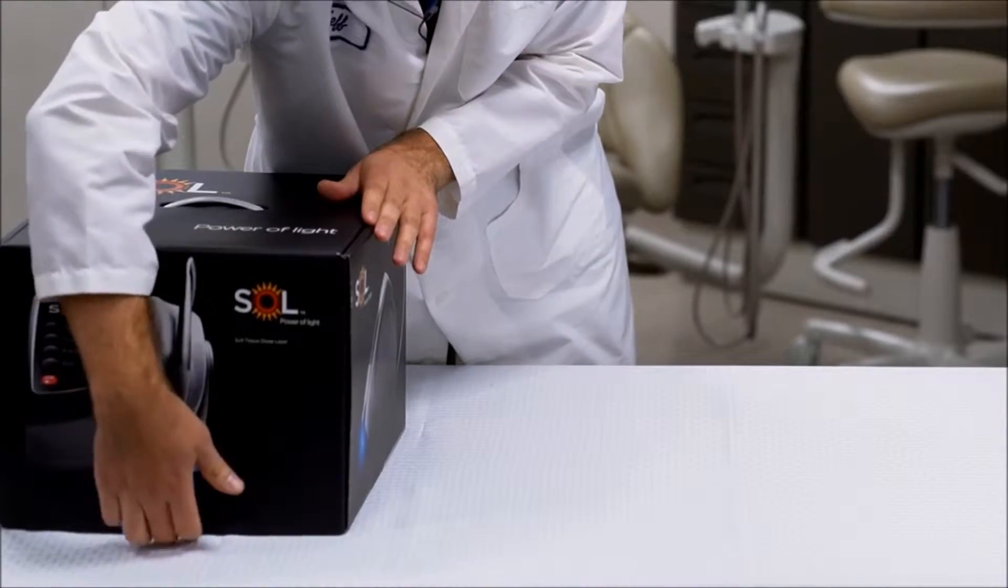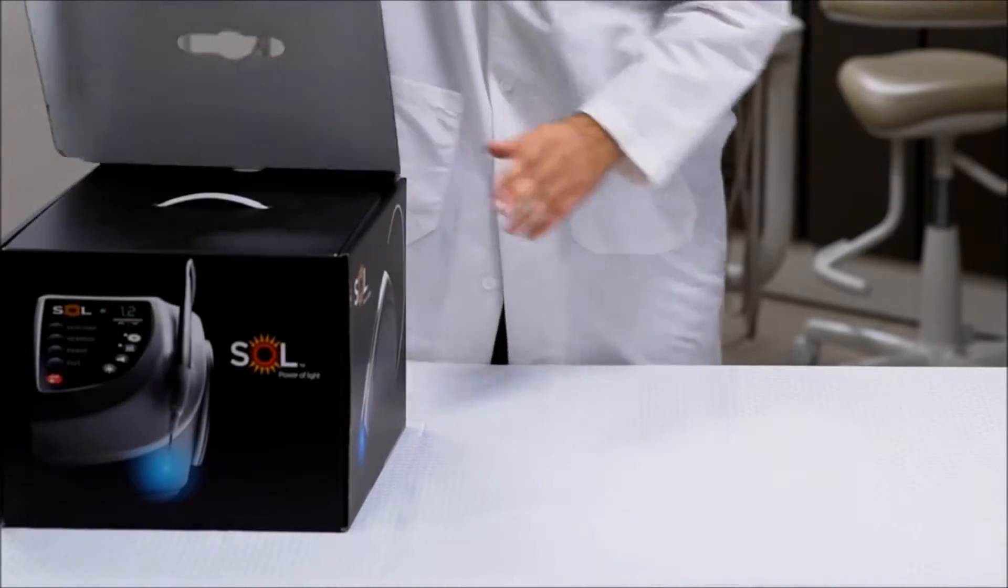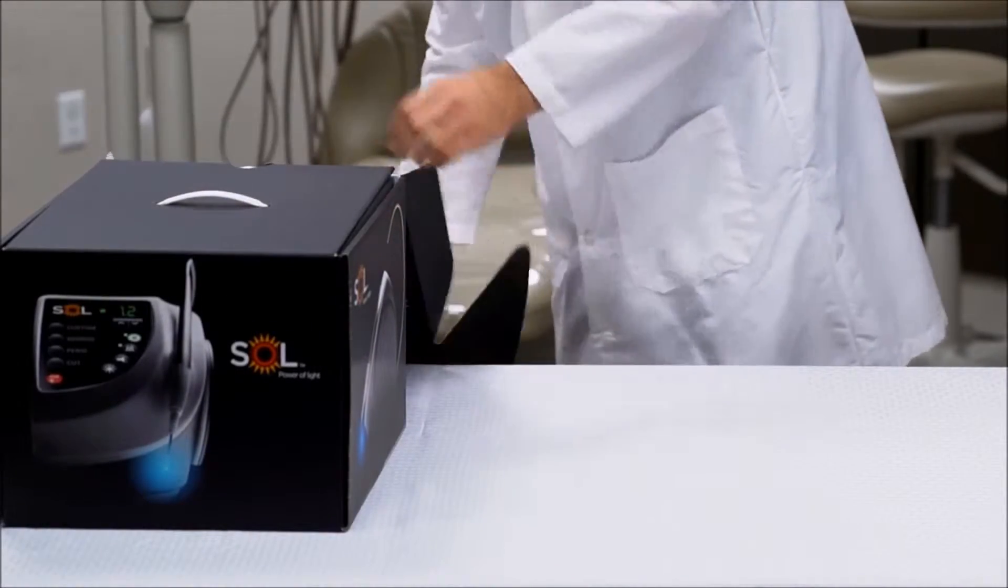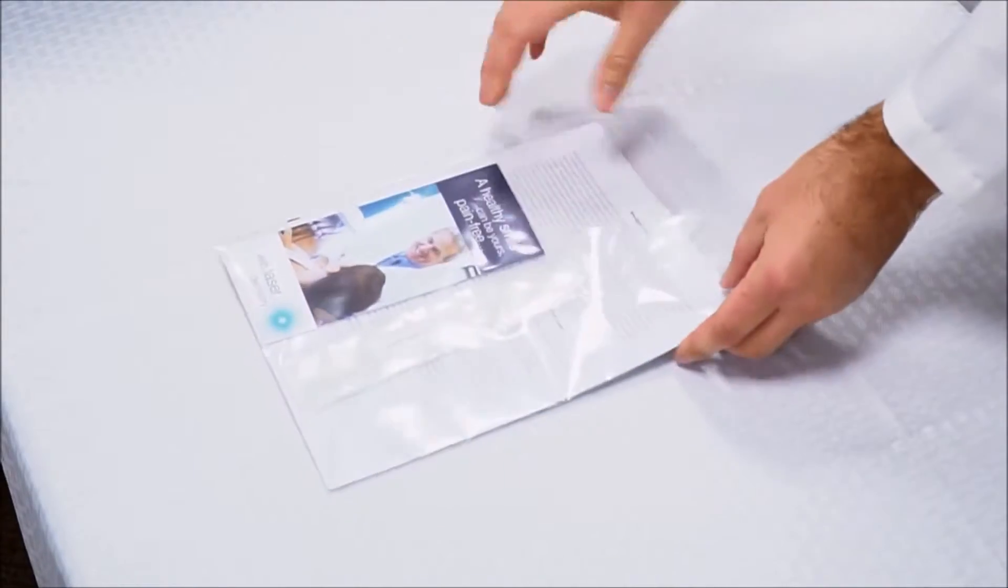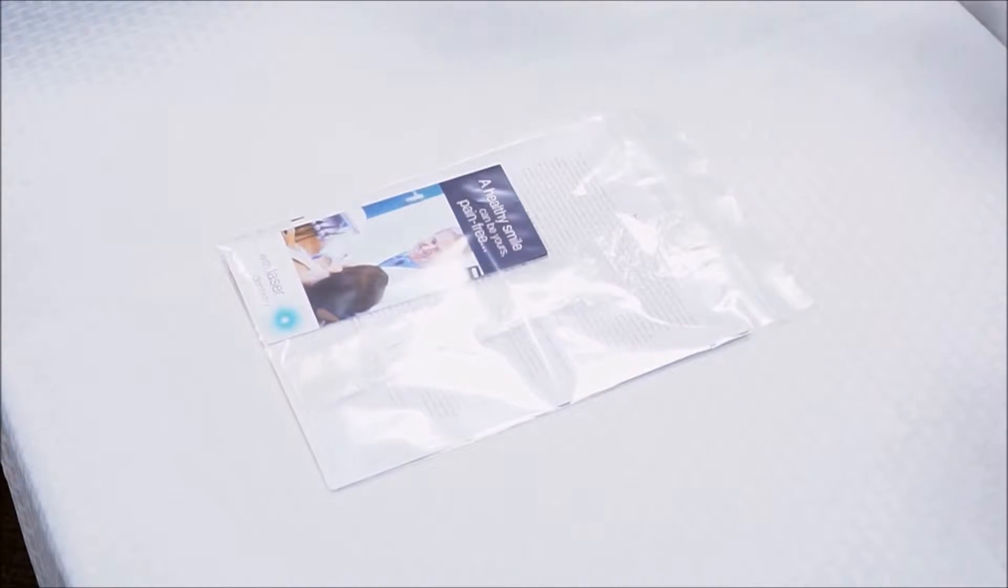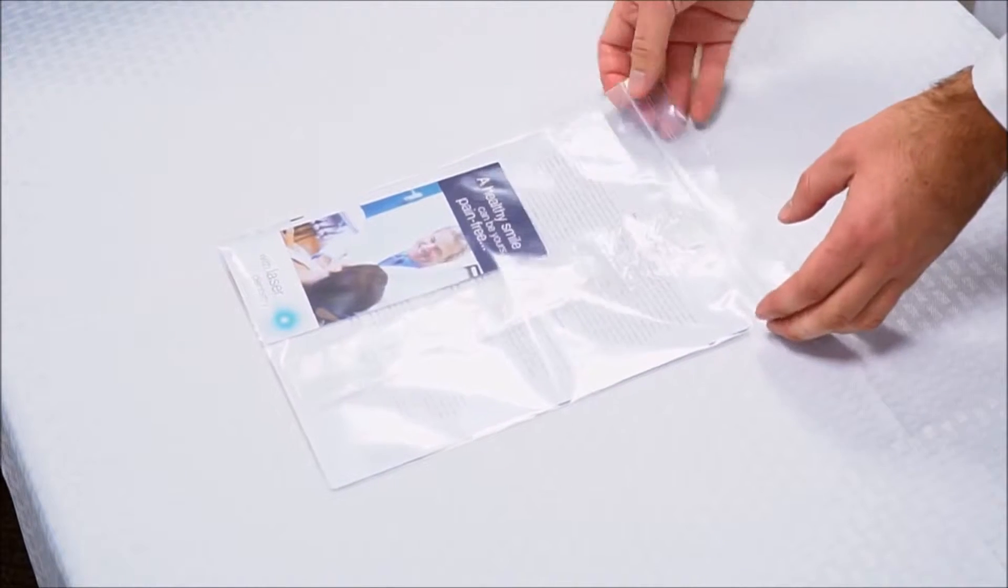Now, unboxing the Sol Laser, you're going to open it up, and the first thing you're going to see inside is this. There is a kit contents package that shows a few various items.